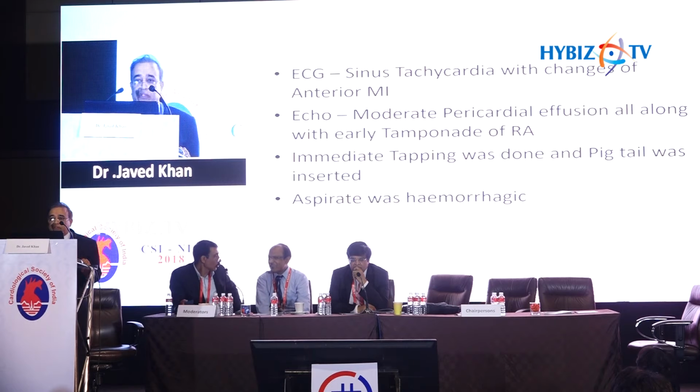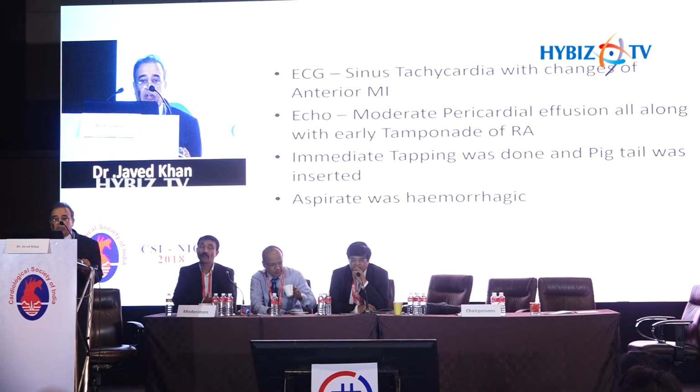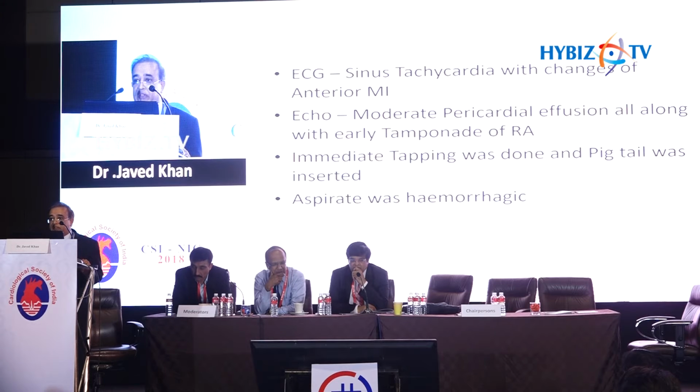Immediately the echo machine was brought to the emergency room, which showed moderate pericardial effusion along with early tamponade features. Immediately in the emergency room the tapping was done and the pigtail was inserted. The aspiration which was done was hemorrhagic in nature.